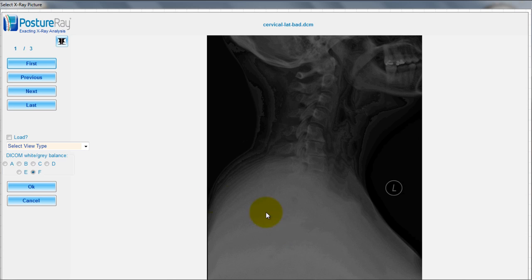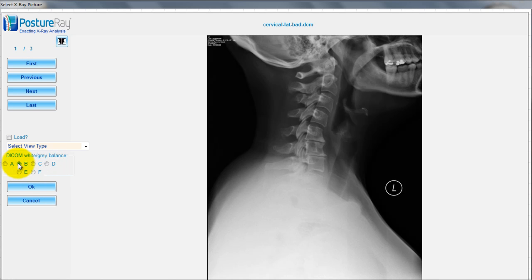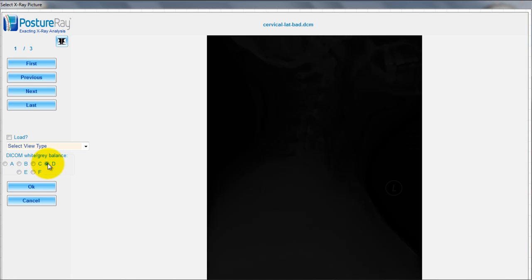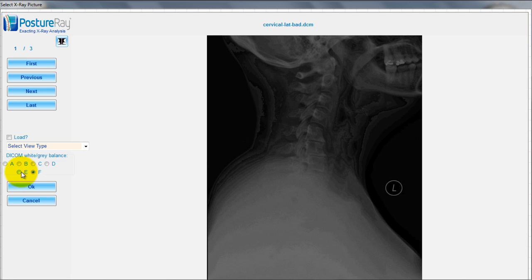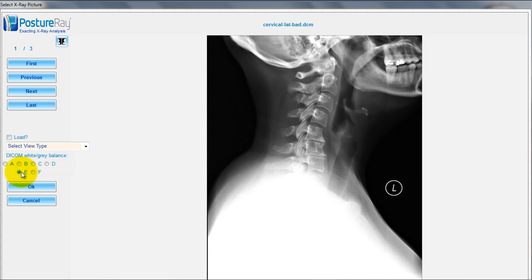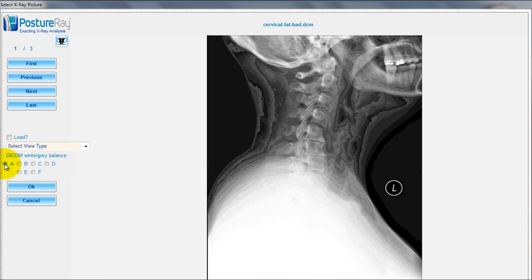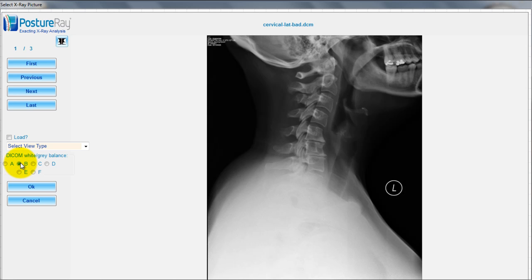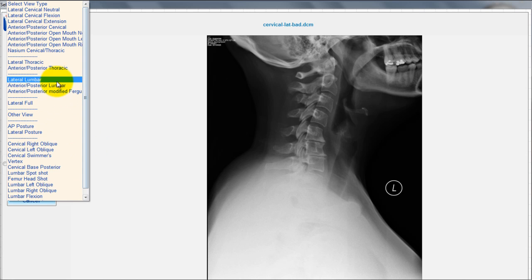So if I wanted to load this person, I can hold down a control or shift. I'm going to hold down control and click. Let's do these three images. And we come up with this screen. Now notice on this, we got the format of A, B, C, D, E, F. These are just different gray scales that are presets. Do you see that? So I can go through and find out what looks the best. That one doesn't look very well. That one's too dark. That one looks a little too white. If I go back to A, that one looks a little grainy. So let's go back to B. Overall, that looks pretty good.